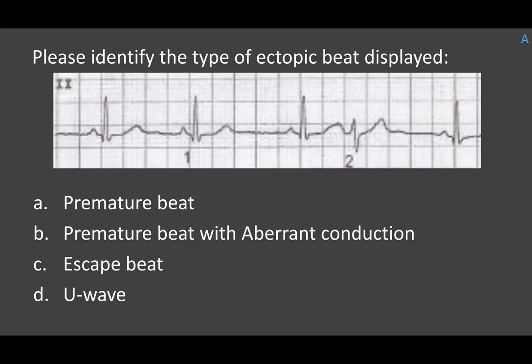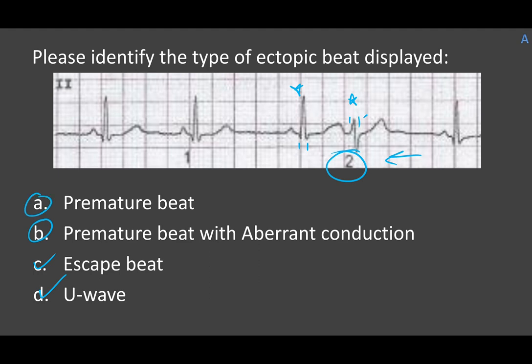Second review question: identify the type of ectopic beat. Beat number two is what we're looking at. It's on the early side, so it's not an escape beat. We're looking at whether this premature beat has aberrant conduction or not. Comparing this QRS to the one before it: they're both narrow, but this one has a completely different conformation. So you're looking at aberrant conduction rather than just a premature beat — premature beat with aberrant conduction is the answer.